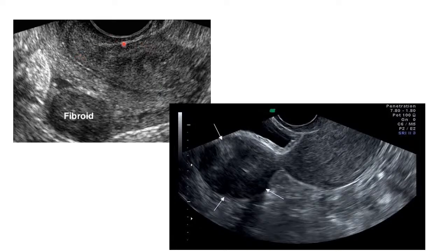So again, if you look here, the uterus, you can see nicely here, we do have got a fibroid. So this one again is a subserosal fibroid, because you can see it's indenting the serosa of the uterus. So this one is the endometrial lining. So you can see going all the way, connecting the cervix there to the rest of the uterus. So there we are. We have got a subserosal fibroid around the isthmus of the uterus there.